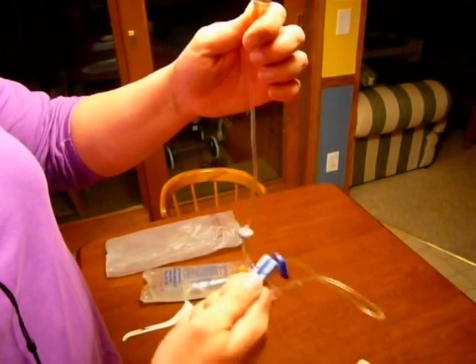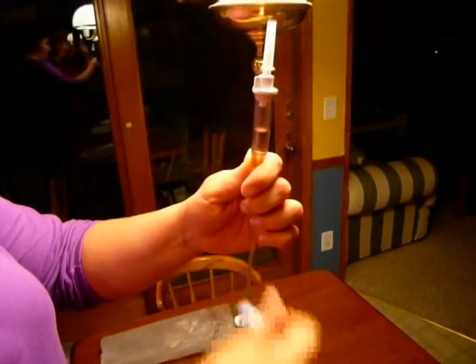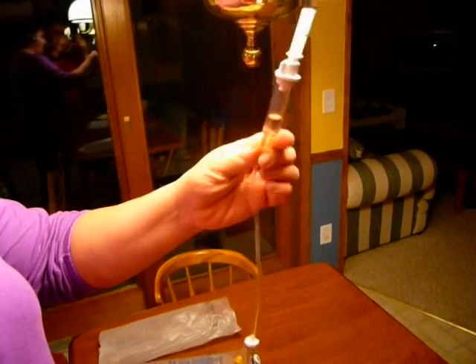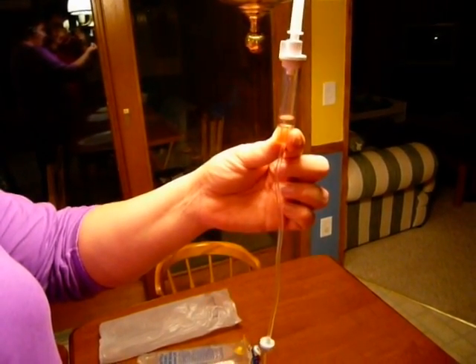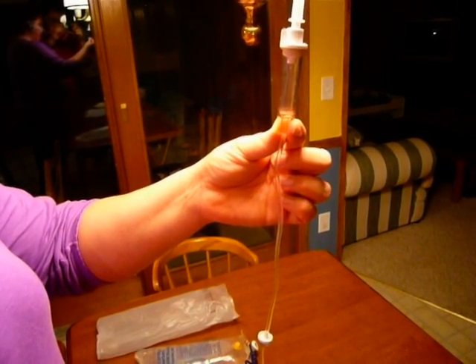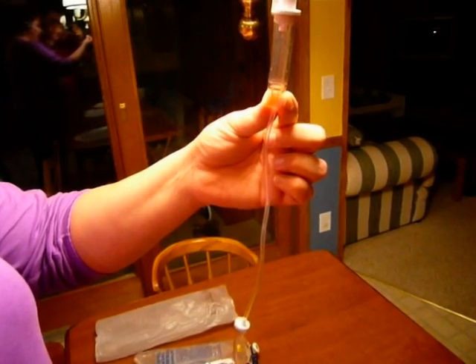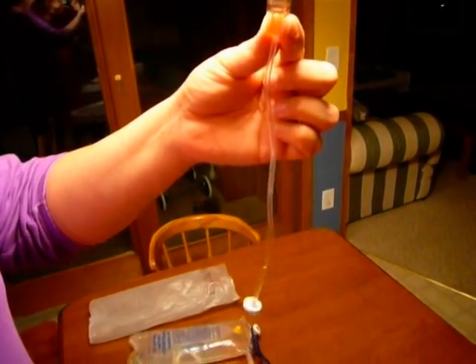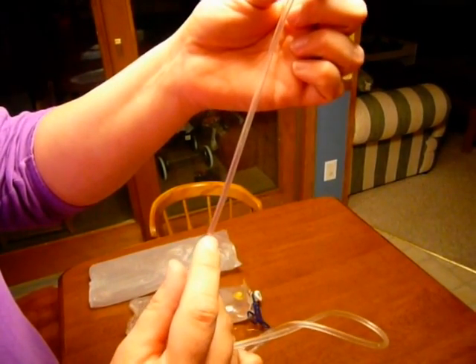I'm going to open my roller clamp to allow the fluid to start dripping down and out of the drip chamber here, and I'm going to watch it slowly come down. I'm going to have control of my roller clamp the entire time to make sure that I don't miss it and allow it to go down too low. So here it comes down the tubing, and right before it gets to the reflux valve, I'm going to stop. So the fluid in the tubing is right here.